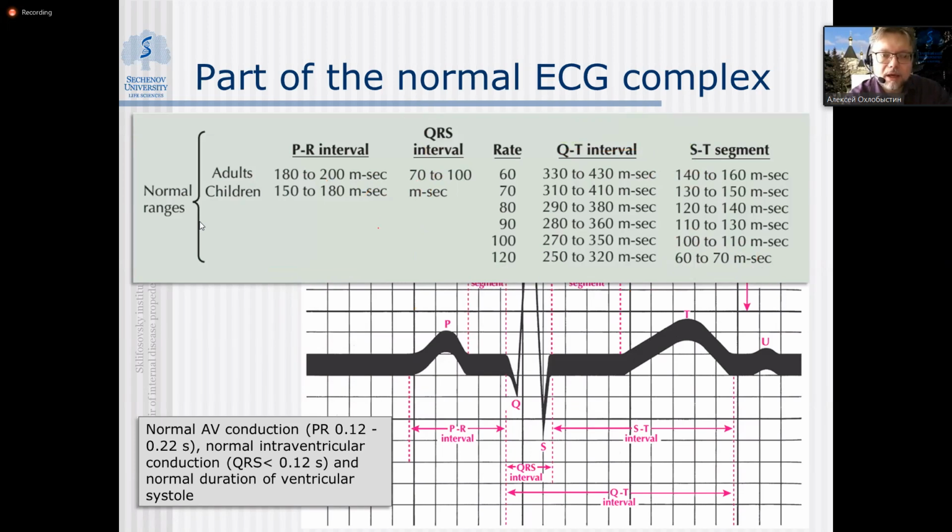Okay. Well, first of all, please remember that we have some fixed normal heart rate that will be associated with normal duration of QT interval, the width of activation of the ventricles, ST intervals. If the heart rate changes, even in an absolutely healthy patient, even in a patient with physiological tachycardia, those intervals representing the activation time and repolarization time of the ventricles will also change.